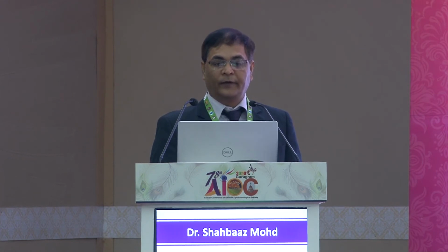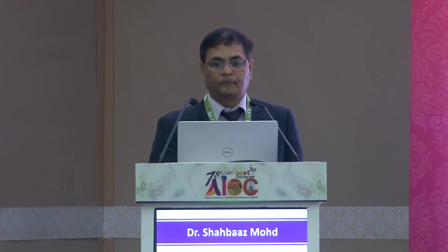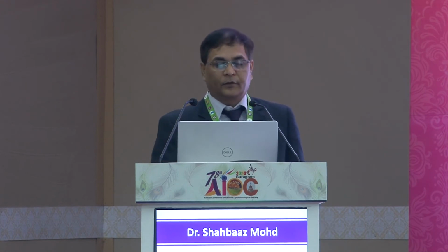This probe we can adjust. If the beam is not correct, you can adjust it. Now the beam is coming, and you can see this will take almost 10 readings and average them out. The ultrasound probe is inserted into this, which we have already seen.